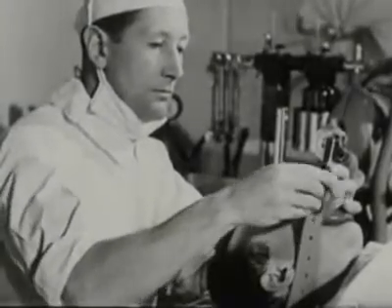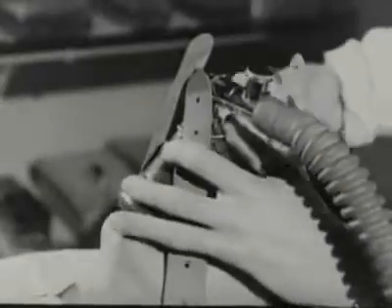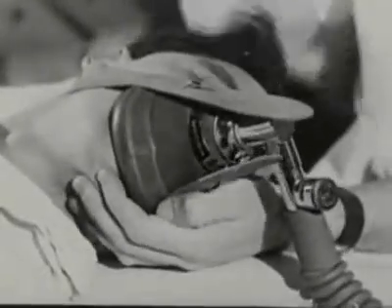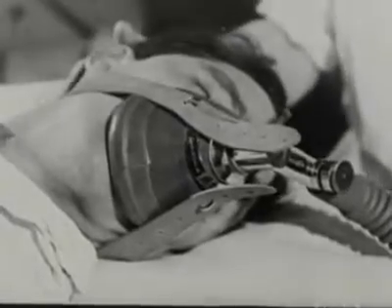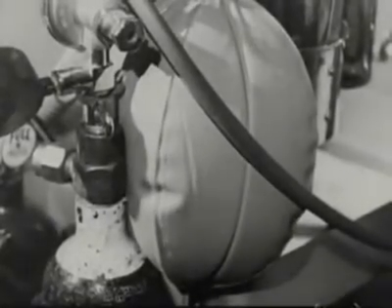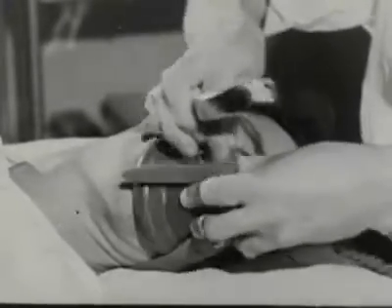The mask can now be strapped to the face by means of the harness, and the head turned to one side. If the breathing is not quite clear, insert an artificial airway.